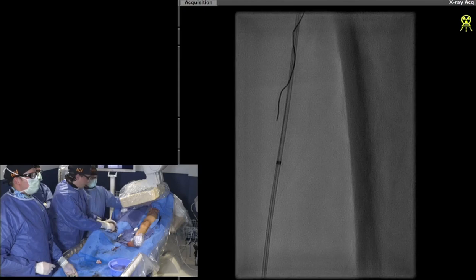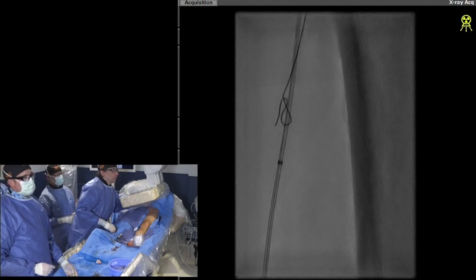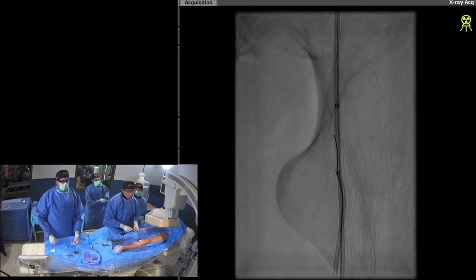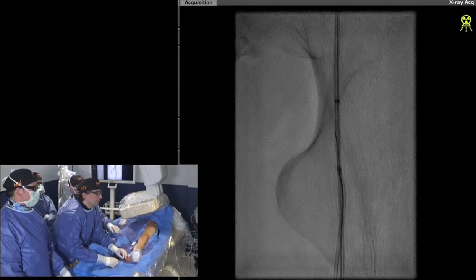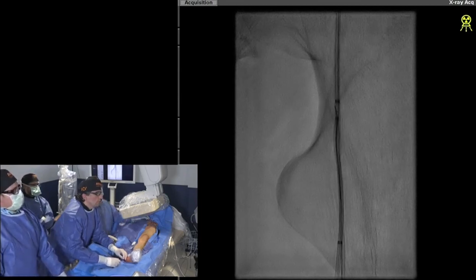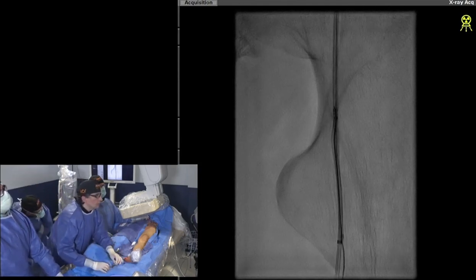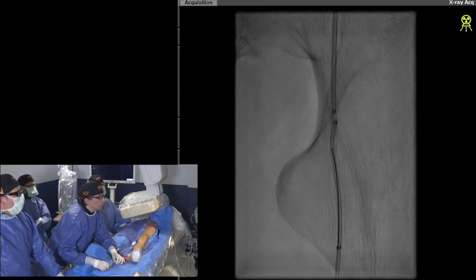You can see the wire from above — you're in two different planes. That's a common finding in this kind of CTO. This CTO is by no means friendly — it's extremely complex. I'm rotating the catheter from above, trying to create a plane. If that doesn't work we'll consider a high-penetrance wire like a Halberd wire, which gives excellent penetrance when the two catheter tips are close. You could torque it well and reconnect the dots.